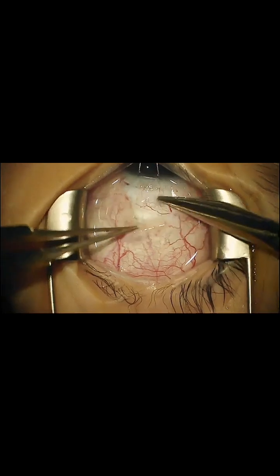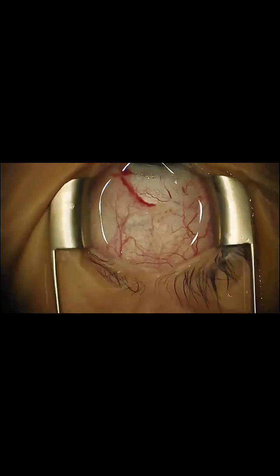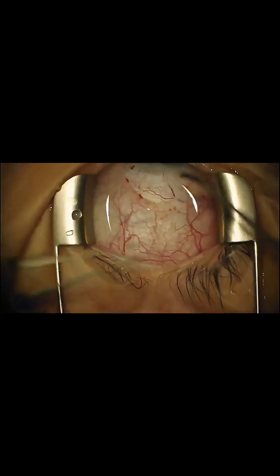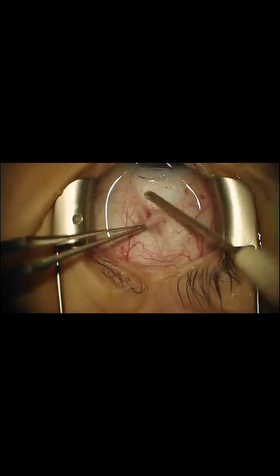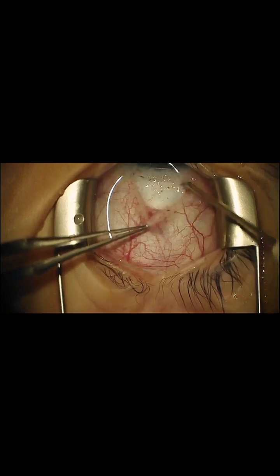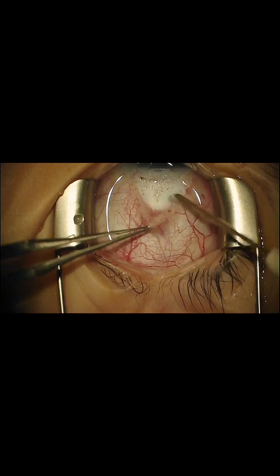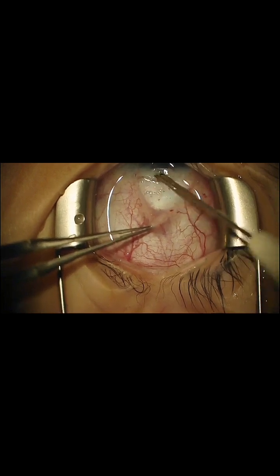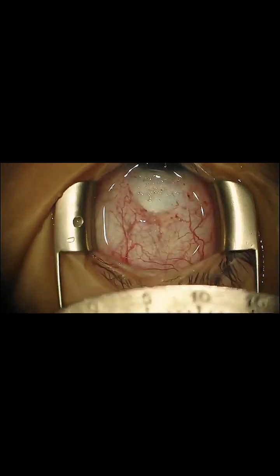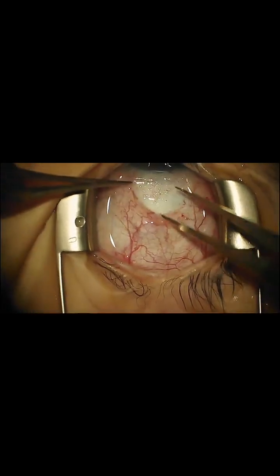We need about a 4 millimeter area here. Take the cautery. What is your preferred shape for the scleral flap? Well, first of all, I don't think it matters. I do a triangle because it's just easy. It doesn't have to filter, right? You're not going to have filtering out of this like a trabeculectomy. All we need is access to Schlemm's canal.